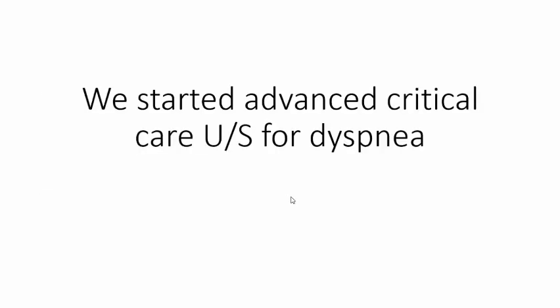We started advanced critical care ultrasound for dyspnea. For those who need certification in advanced critical care echo, whether American or European, you need to follow this protocol, please. You need to do all this examination to get your diagnosis and to complete your logbook in a nice way.